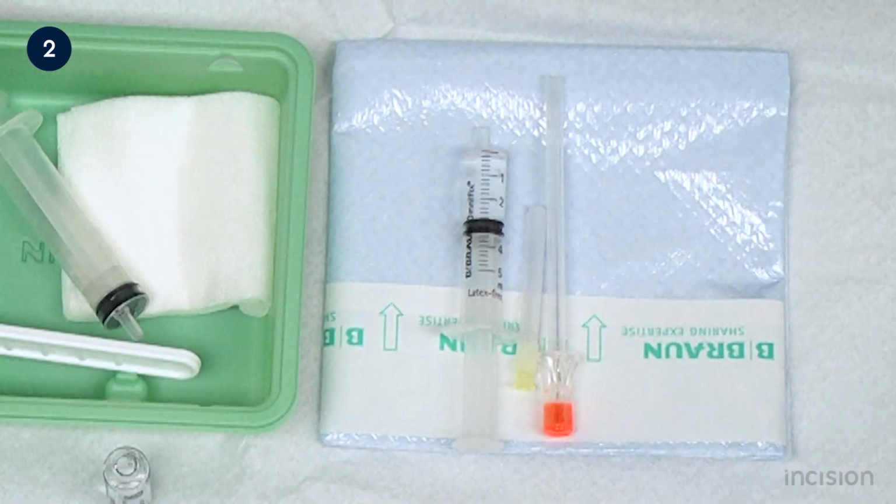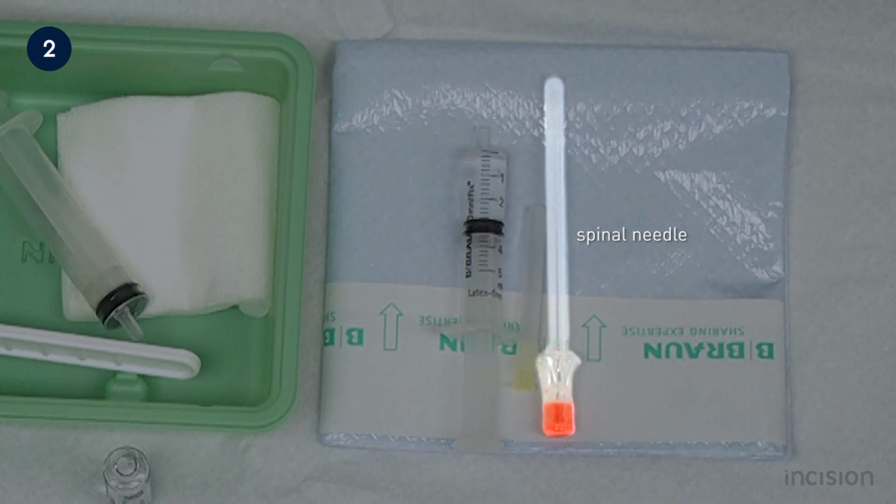The spinal needle is available in different types and sizes. Selection of the type and size should be guided by the patient's profile. Large needles, for example, are known to be more likely to cause the complication of post-dural puncture headache in young pregnant patients, and their use in this group is avoided.